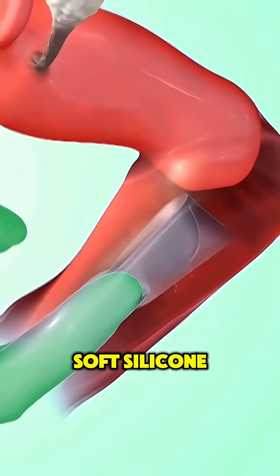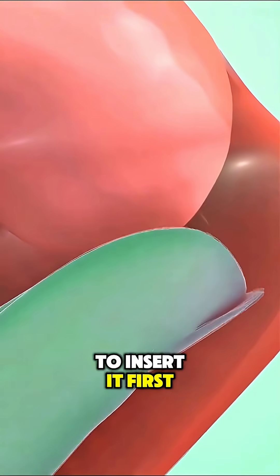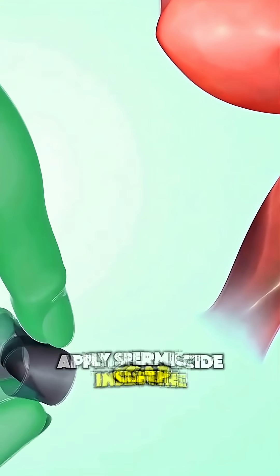A cervical cap is a small, soft silicone cup used for birth control. To insert it, first apply spermicide inside the cap.